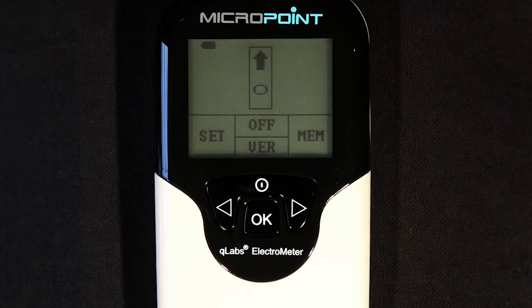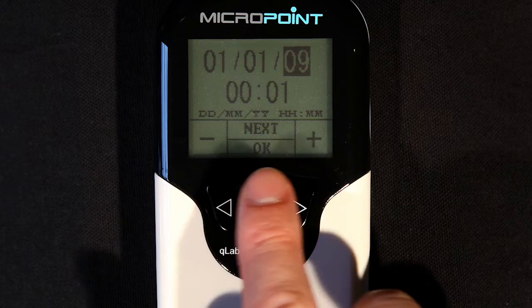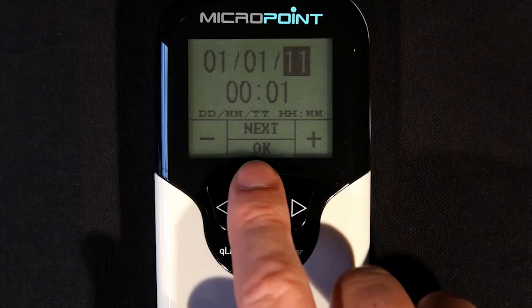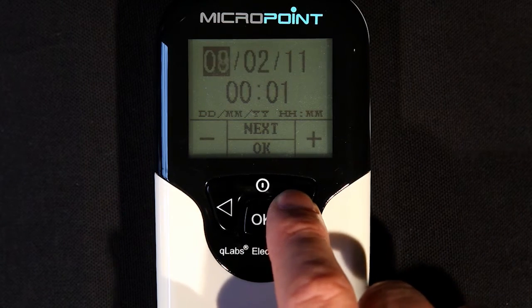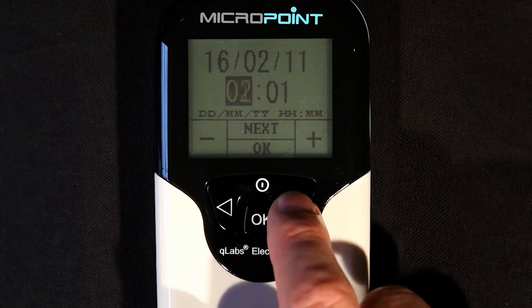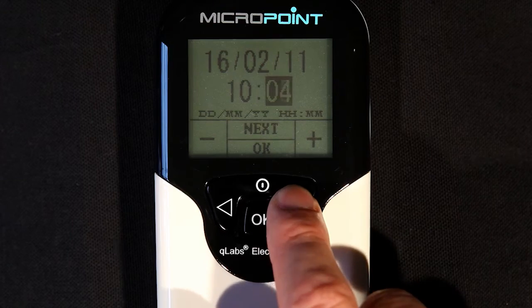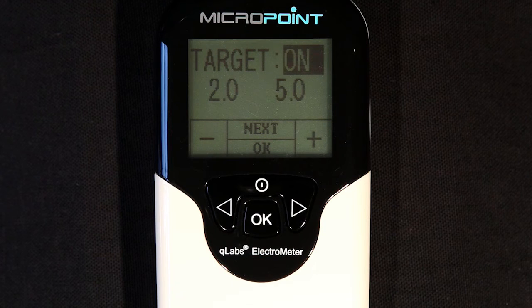If you wish to enter the setup mode, simply press the left button from the home screen. Once in the setup mode, use the left and right arrows to decrease or increase the values of the highlighted field. To select the next changeable field, press the power button. When all settings are acceptable, press the OK button to confirm settings. In the setup mode, you can change the date, time, and target range settings on the Q-Labs Electrometer.